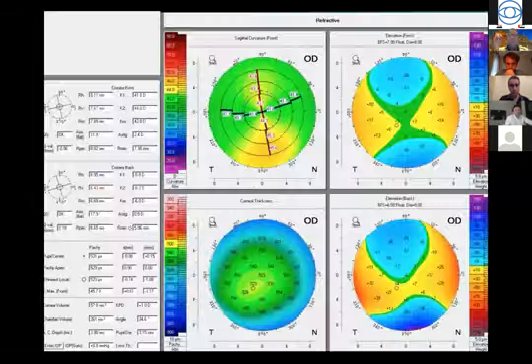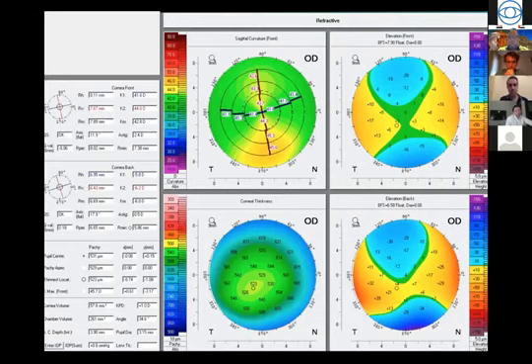From time to time, of course, we see such hotspots on the anterior curvature map, and we wonder whether they are signs of early keratoconus or maybe some artifacts, as the panelists had mentioned before, such as dry eye, eye rubbing, contact lens use.